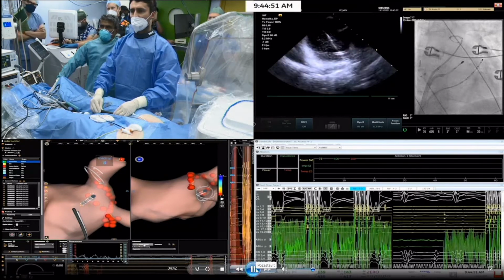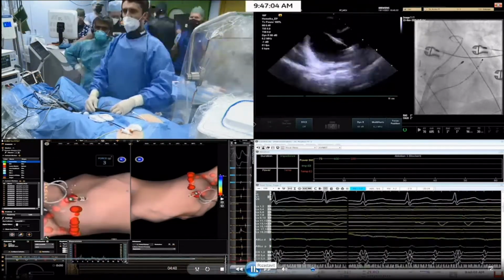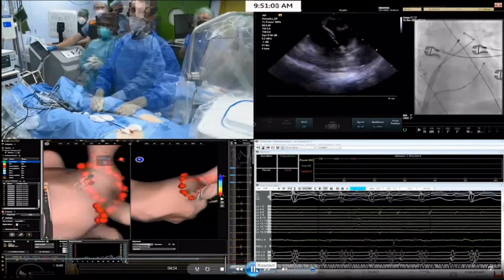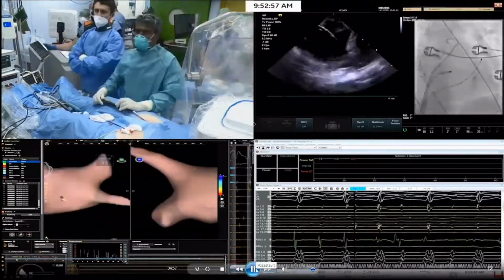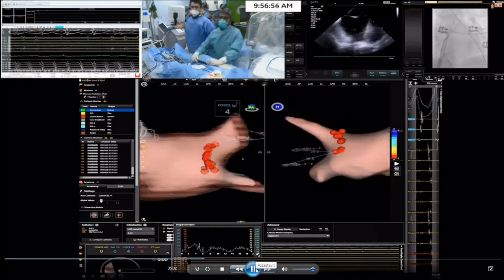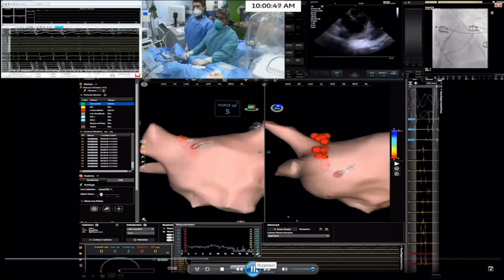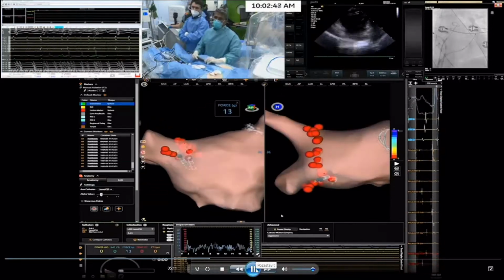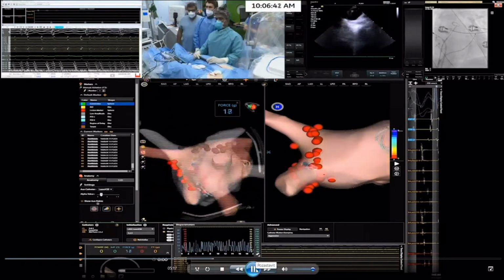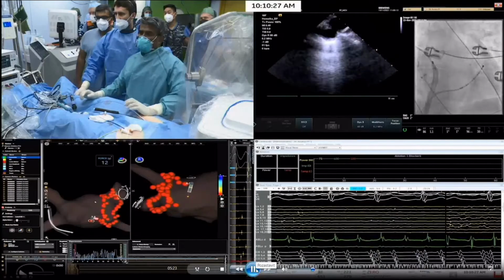So we need to finish the circle anyway. So despite electrical isolation being evident, he will finish the full circle, and because he is tired, he will be replaced by Jacob. So for the right side, Jacob is doing his line, and look at the activation. Which is very fast, but actually after the left, the activation of arrhythmia changed and stabilized. So the cycle length went longer and stable.